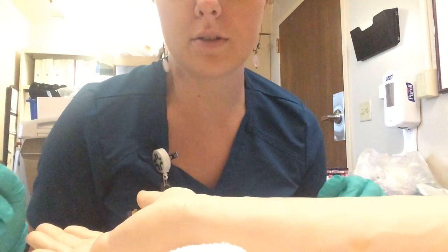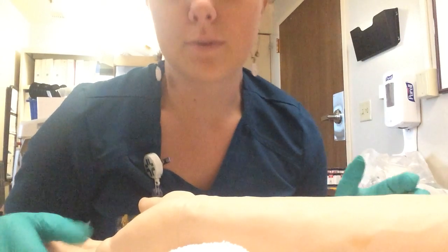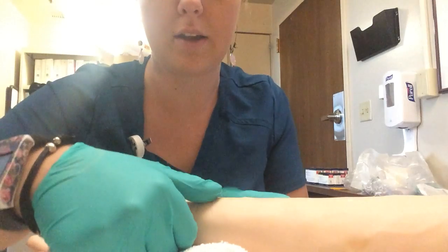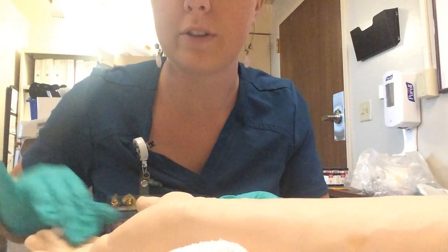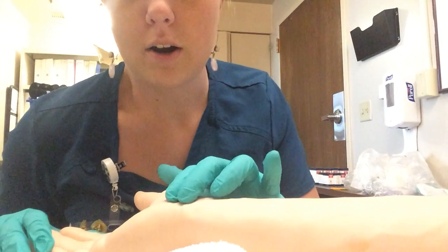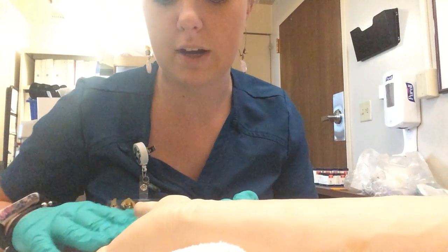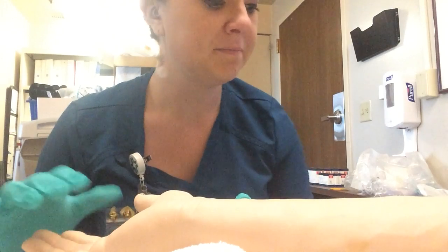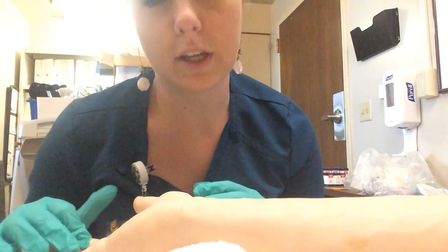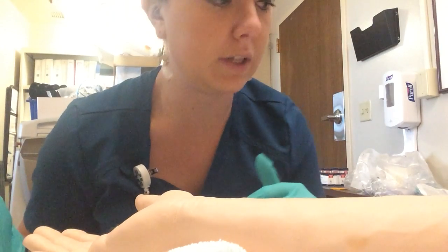I got the doctor's orders for an ABG on this patient. I confirmed the doctor's orders. I confirmed the patient's name and date of birth. I performed an Allen test to make sure that the patient had good circulation with their ulnar artery, so if anything goes wrong they'll still have good blood flow to their hand. I've gone over the possible risks and complications with getting an ABG and why an ABG is different than getting your blood drawn regularly.